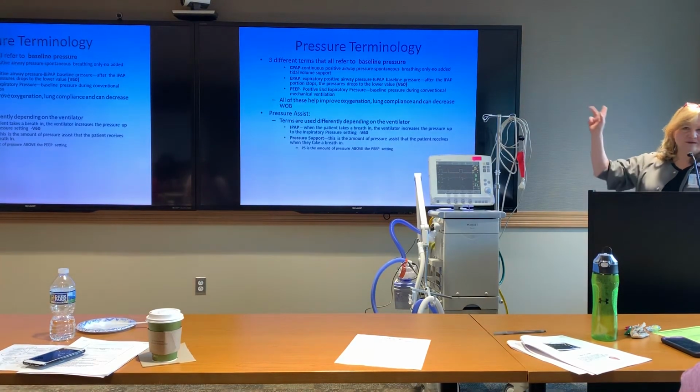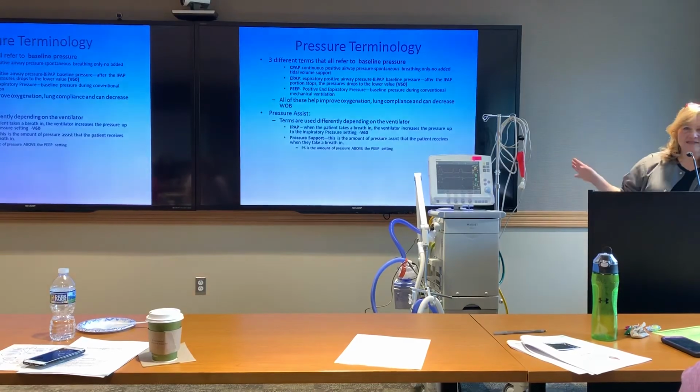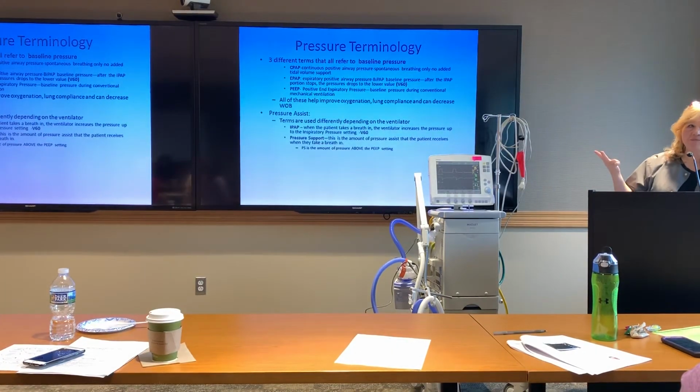All right, and this is the one I told you about. 3 terms for the same thing, right? CPAP, EPAP, PEEP.